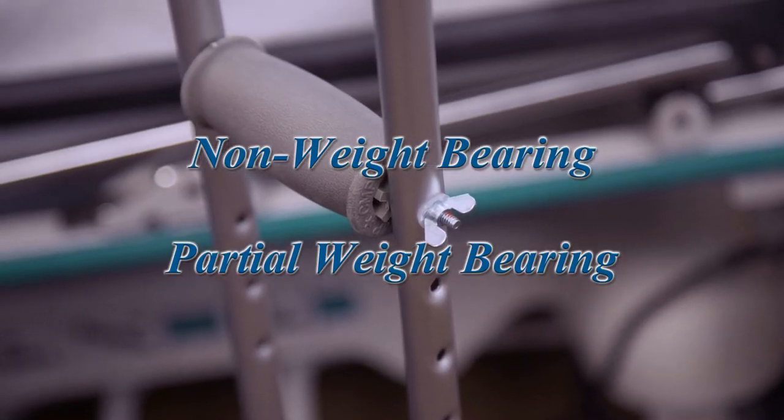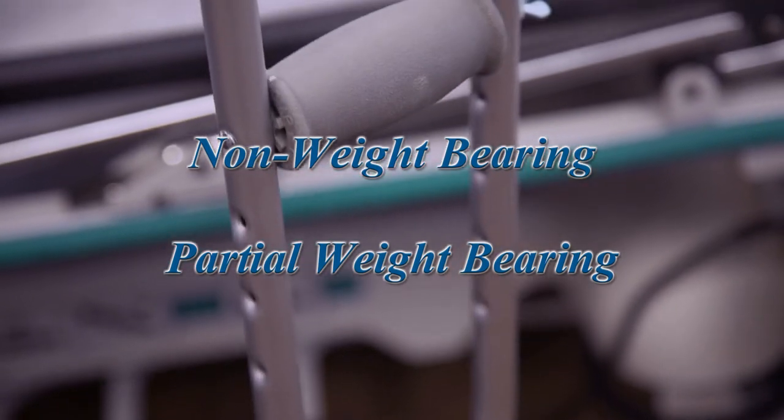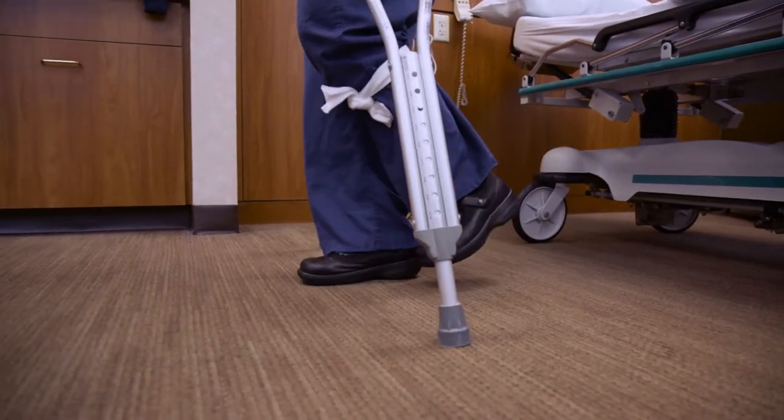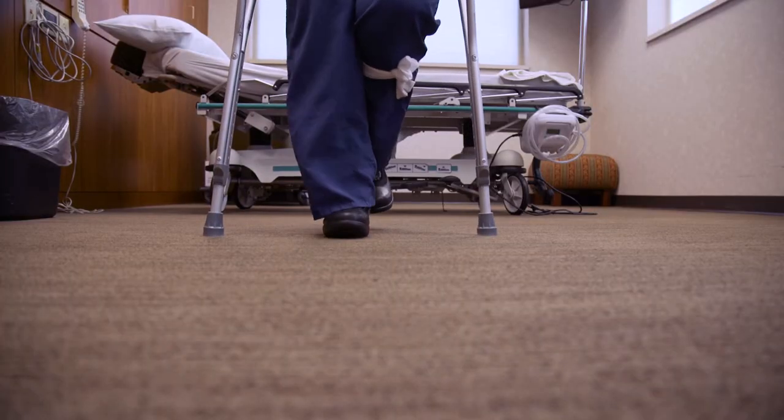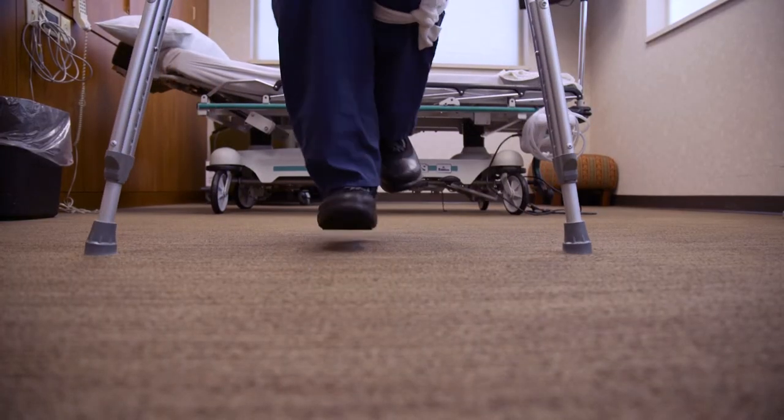There are two ways to walk: non-weight bearing and partial weight bearing. For non-weight bearing, the crutches are a substitute for your surgical leg. Plant your crutches first and swing your body through. Place no weight on your surgical leg.